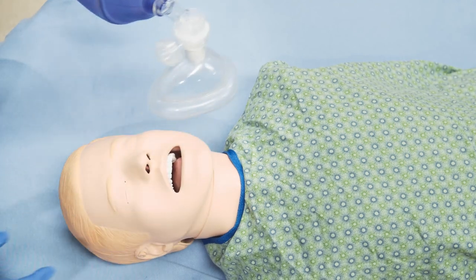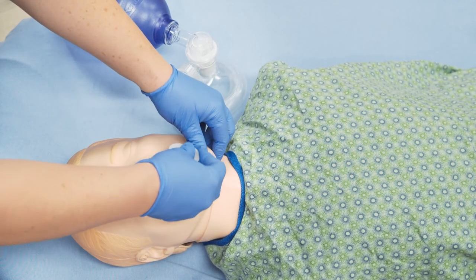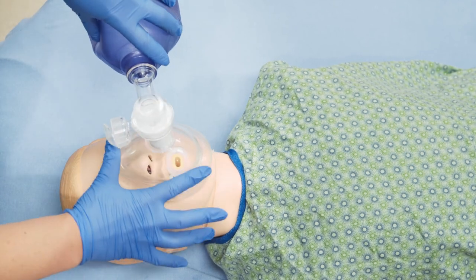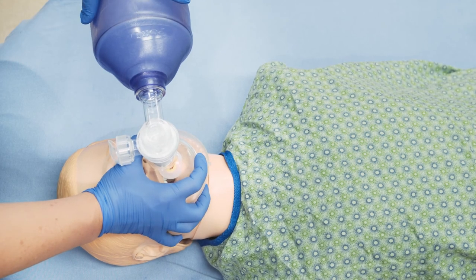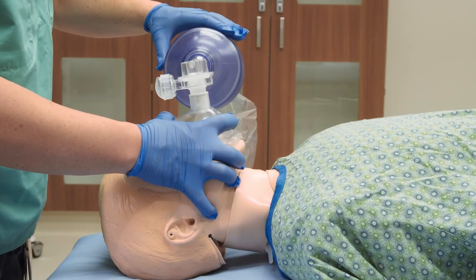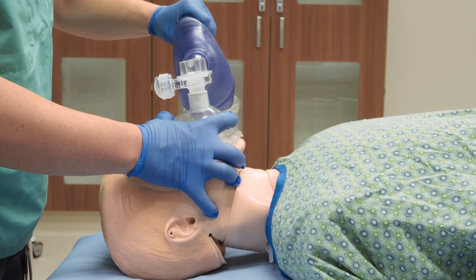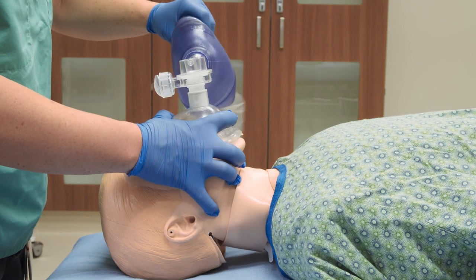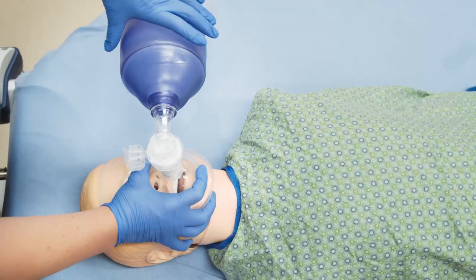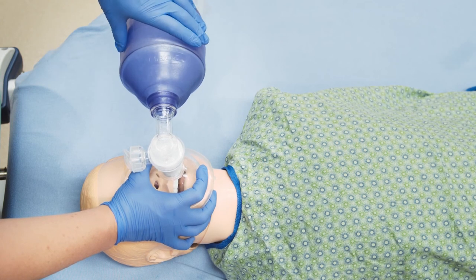Be sure to insert an oral or nasopharyngeal airway device if not already in place. Hold the bag in one hand and depress the bag enough to make the chest rise to about one-third of its volume for an adult. Squeeze the bag over one to two seconds to provide chest rise. Giving the breath faster can cause lung damage. After each breath, allow the chest to fall before giving another breath.